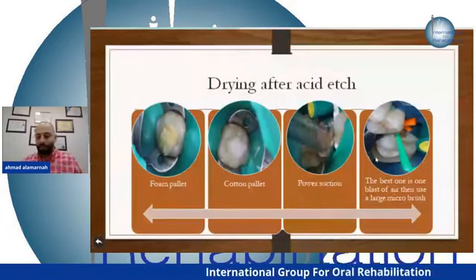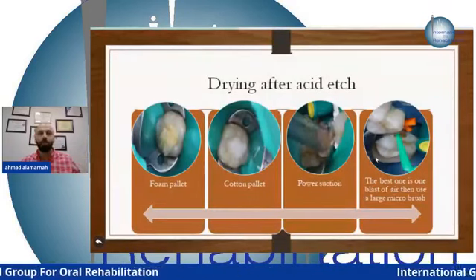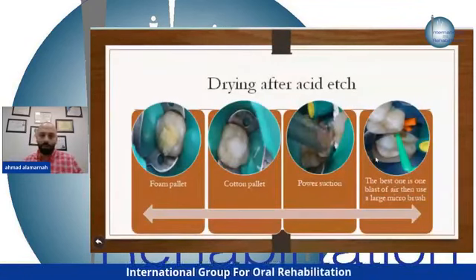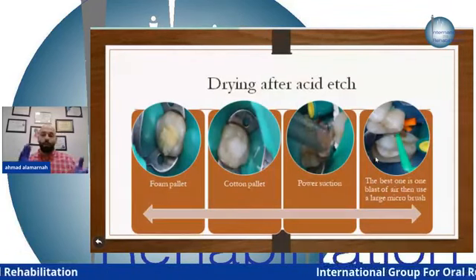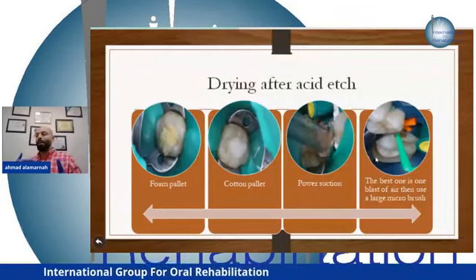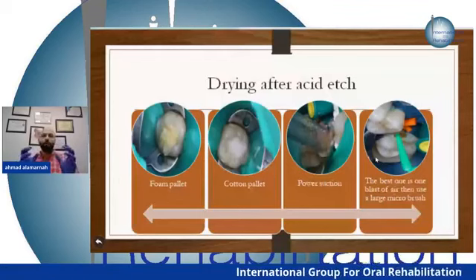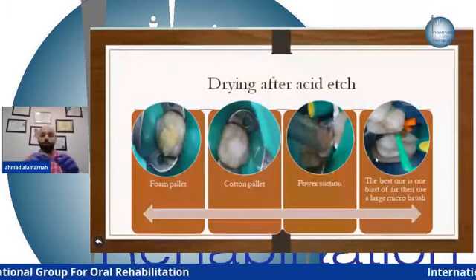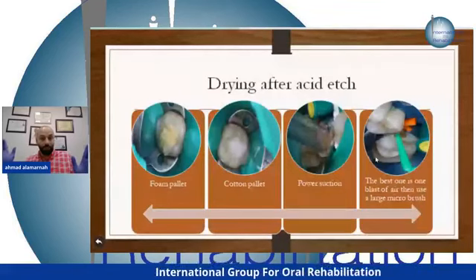Why? Because the older dentists that have used the acid etch or the composite from its beginning, they had the acid etching in its liquid form, okay? Nowadays, we have the acid etching in its gel form, okay? So they introduced the gel form because of the debate about enamel only or dentine only. So we have to control the etching gel, okay? They control the etching, so they make it as a gel to place it in places and not move to other places, okay?